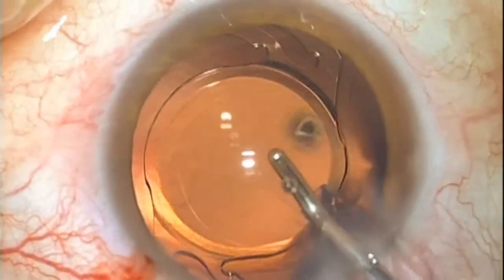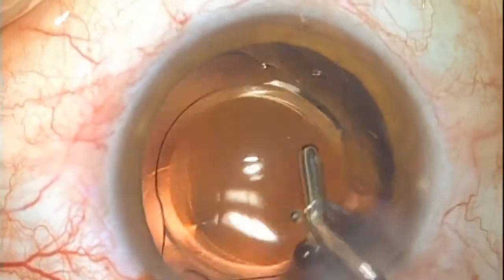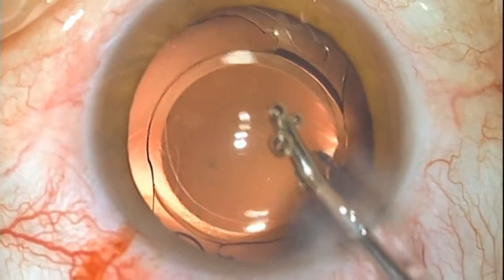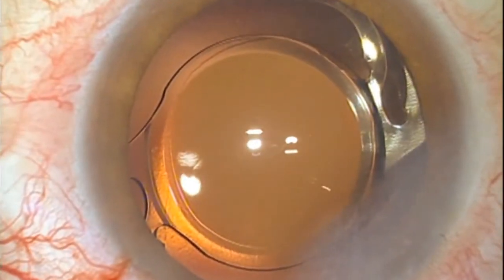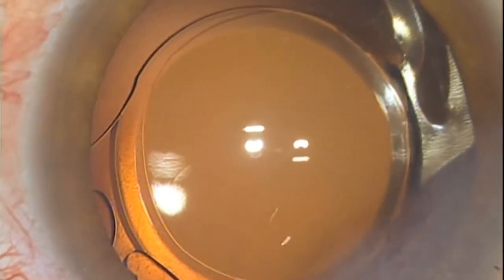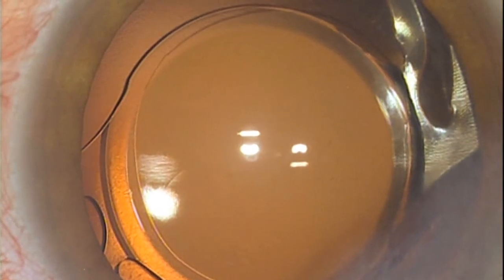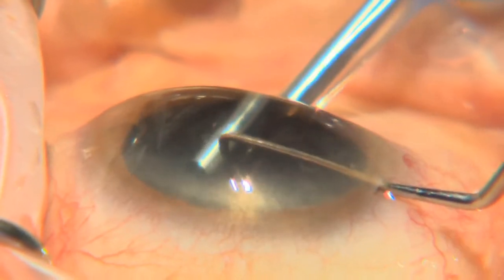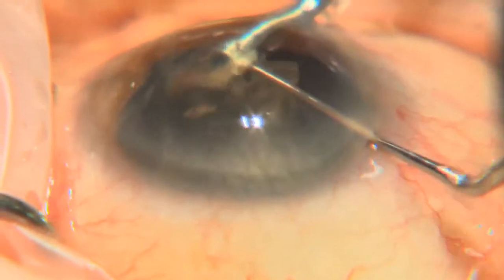In my view, we also have an excellent design for a toric lens. The biflex lens can go through a 1.8mm incision. Personally, I prefer to work with a 2.0mm incision to guarantee totally safe phacoemulsification. A 1.8mm incision is still currently a bit too small as it affects the fluidity of the phacoemulsification.